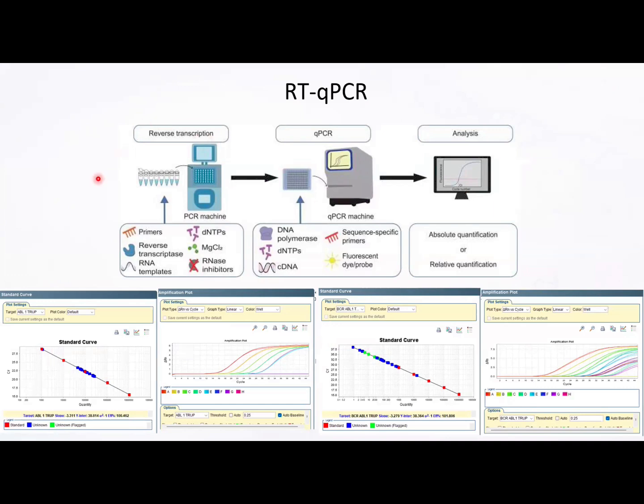First of all, the RNA from the sample has to be extracted. This RNA has to be converted into the cDNA, or the complementary DNA, using reverse transcriptase and random primers. This cDNA is again put forward into the PCR. So this PCR happens using a set of standards. Certain standards have to be identified. These standards are commercially available, and this has to be diluted, or you can get pre-dilutions from the vendor.